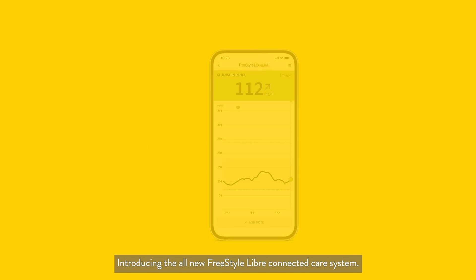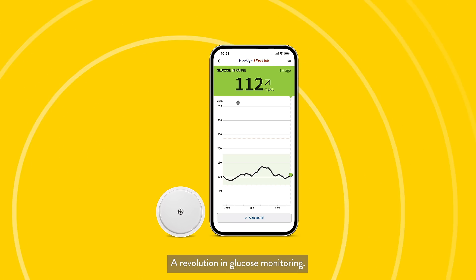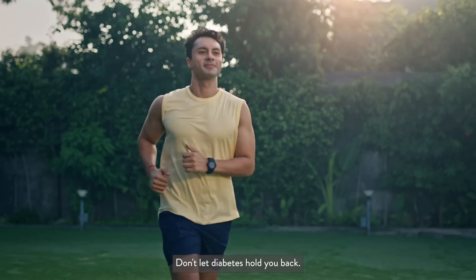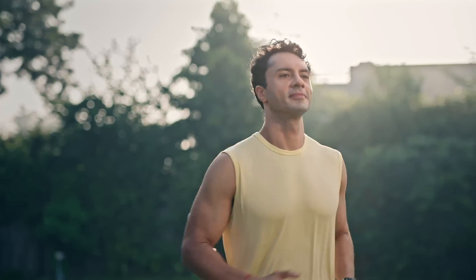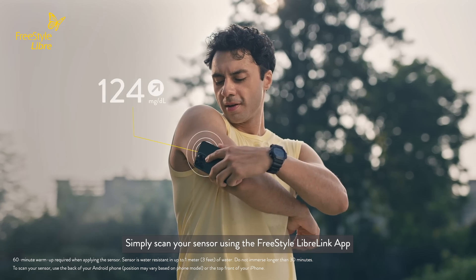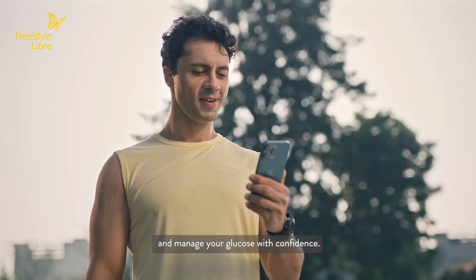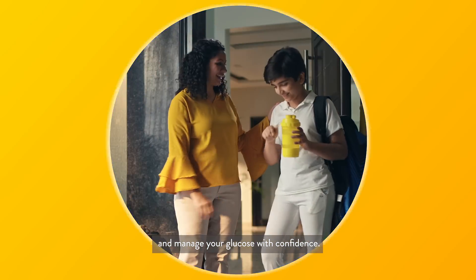Introducing the all-new Freestyle Libre Connected Care System — a revolution in glucose monitoring. Don't let diabetes hold you back. Monitor your glucose levels anytime, anywhere. Simply scan your sensor using the Freestyle Libre Link App and manage your glucose with confidence.